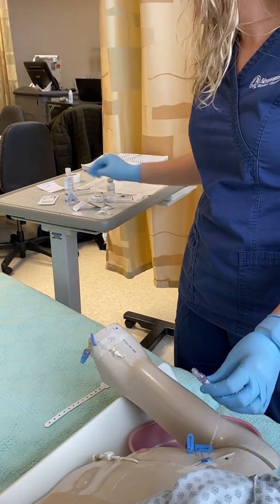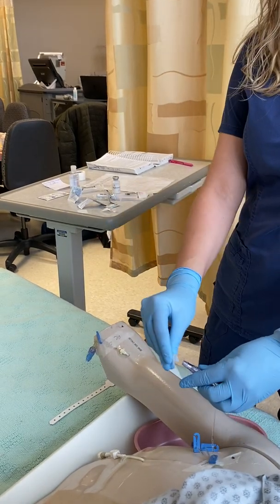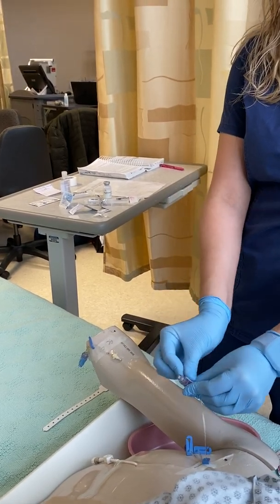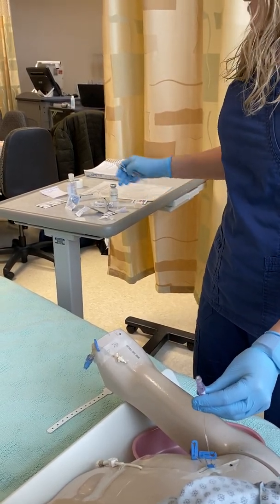Oops. In a real case, I would not use this. I would grab a new one. Being careful not to touch that.